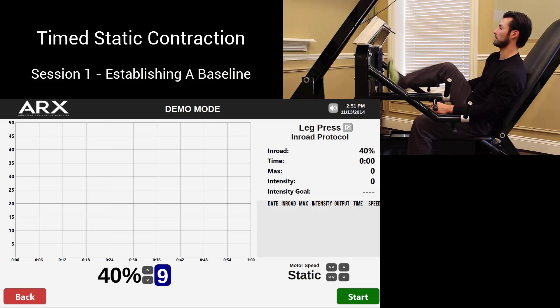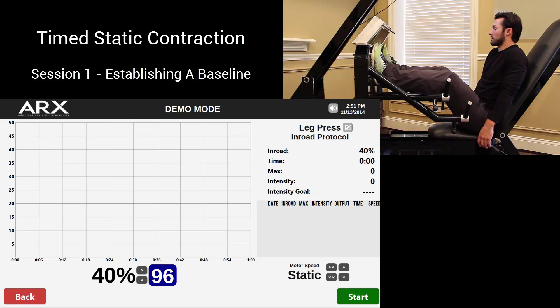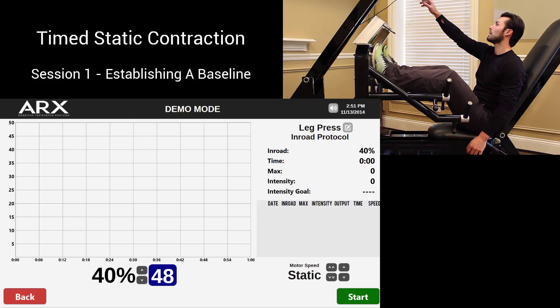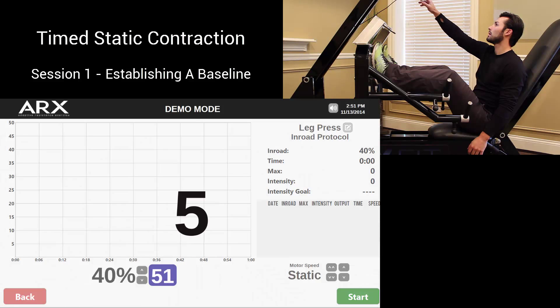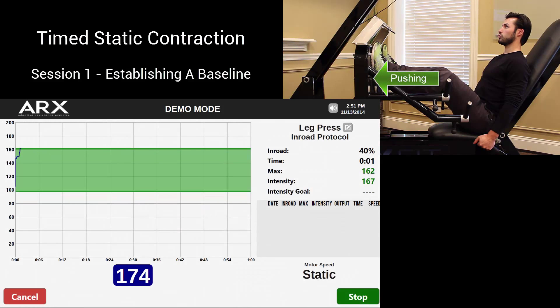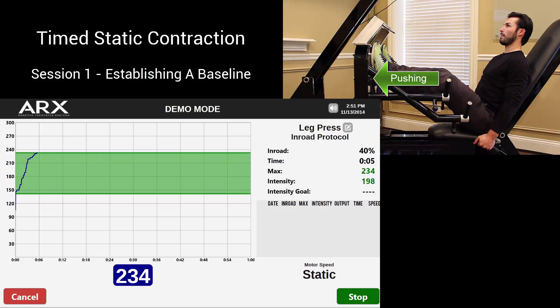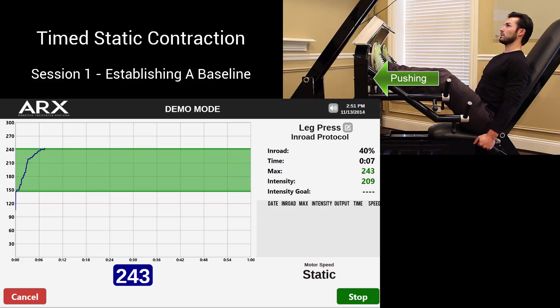This is a demonstration of a timed static contraction protocol that would be used in a rehabilitation context using ARX's adaptive resistance technology and proprietary data tracking software. For therapy and rehabilitation following an operation, progressive strengthening of the joints in question and the surrounding musculature is a top priority. Our technology accomplishes this muscular work in maximum efficiency and safety while precisely quantifying the patient's progress.